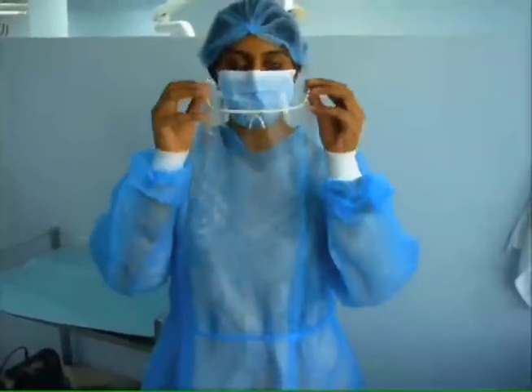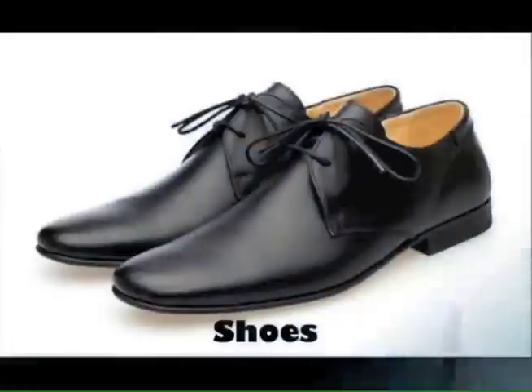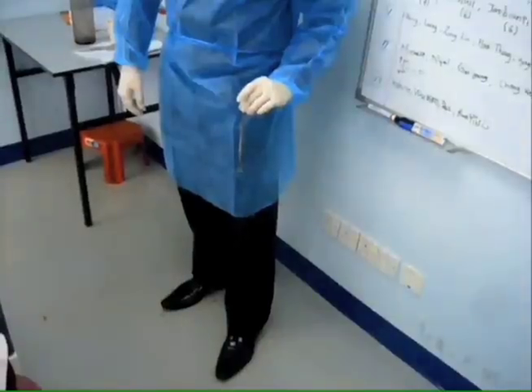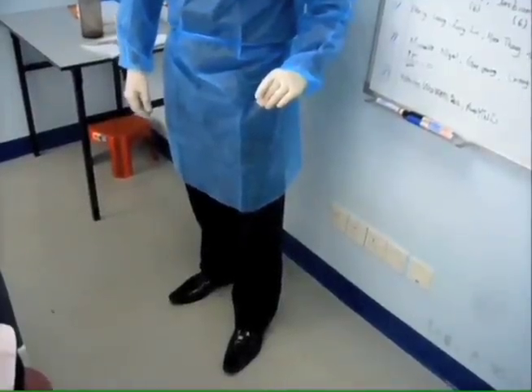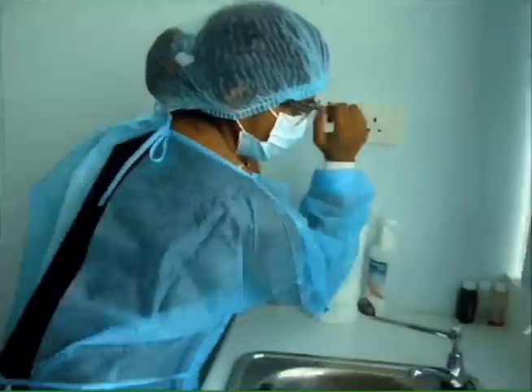Alternatively, a face shield can also be worn. In the clinics, we should wear closed shoes. This is to prevent injury if there are any accidents, for example, dropping of instruments. Before gloving, it is important to wash our hands.